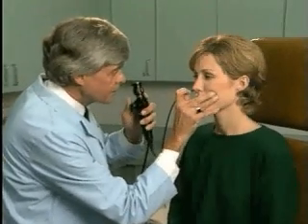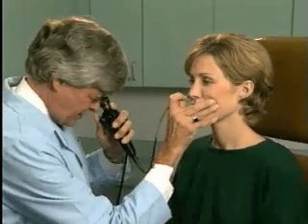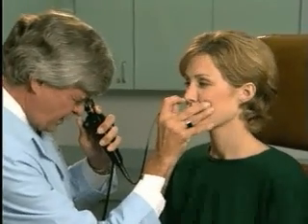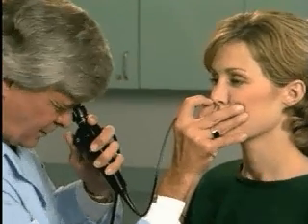Begin by inserting the tube into the anterior naris, directing it along the floor of the nasal cavity. If there's resistance or pain, immediately withdraw. If there's an obstruction, just insert the tube into the other side of the nasal cavity.